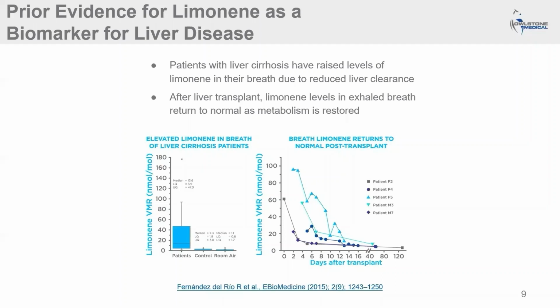These data suggest that limonene functions not only as a biomarker for liver disease, but also for liver function. Moreover, if correct, limonene may provide a readout for monitoring the effectiveness of therapeutic intervention for liver disease.